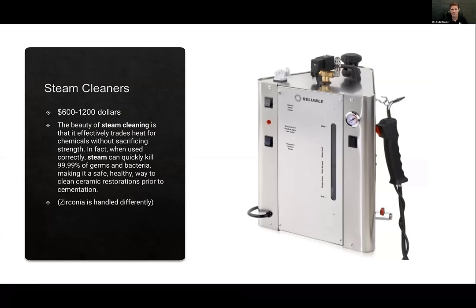The wonderful thing about steam cleaners is that they not only remove debris, but they also kill bacteria. Anything over 100 degrees, as you're hitting the bacteria with this heated source of air and steam, they basically denature and die off, right? So we kill bugs at the same time. Wonderful. So we're decontaminating and removing debris.